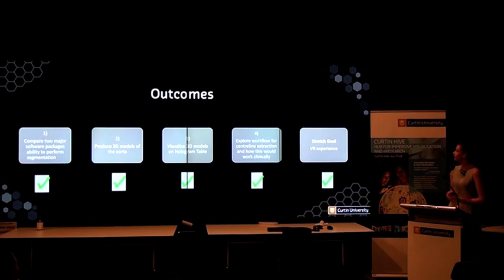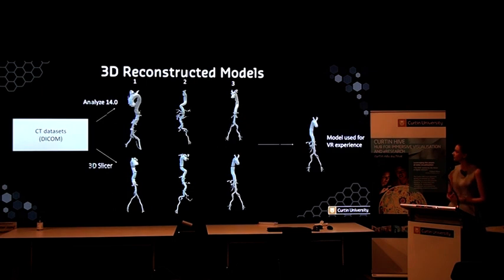Thirdly, visualising in the hologram table, and exploring the workflow of actually getting to the point where you can make it a VR experience and how that would work clinically. And then the stretch goal was to create the VR experience. We're having a bit of trouble today running it in Unity, but hopefully we'll be able to show you a little bit of it after.